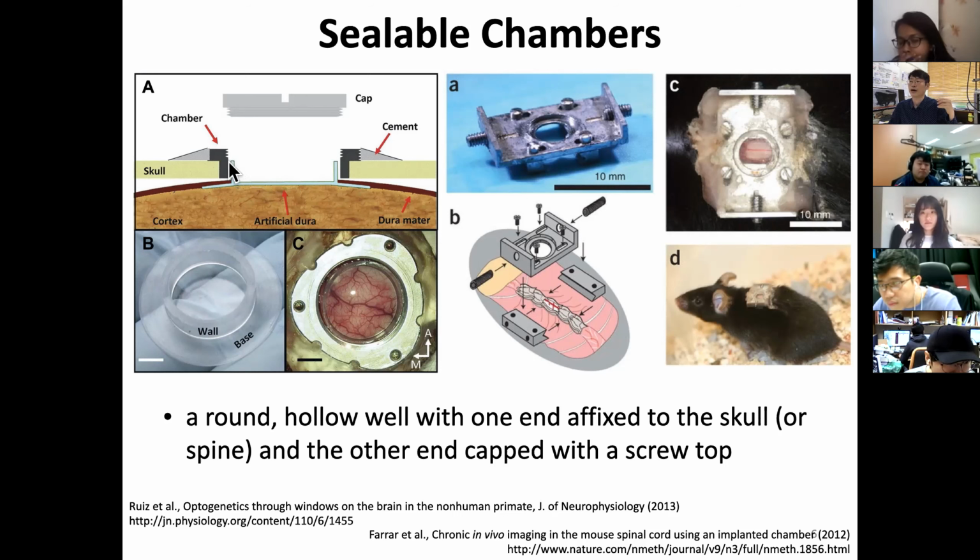And then you can see these dark lines are actually dura mater, which Shukla nicely told you is very sturdy, covers the brain, and inside there's CSF.